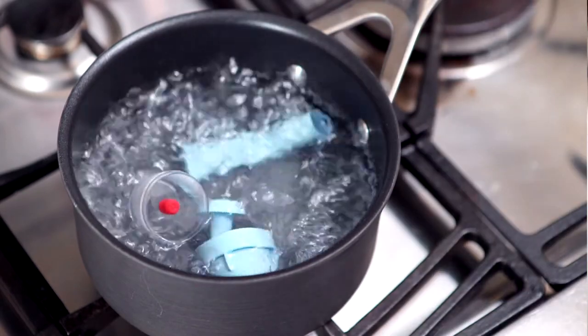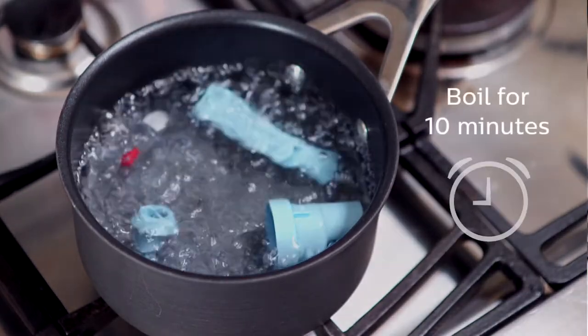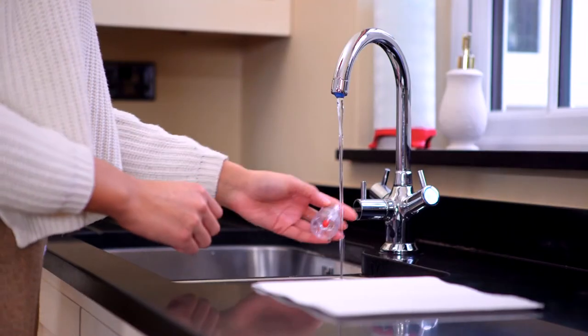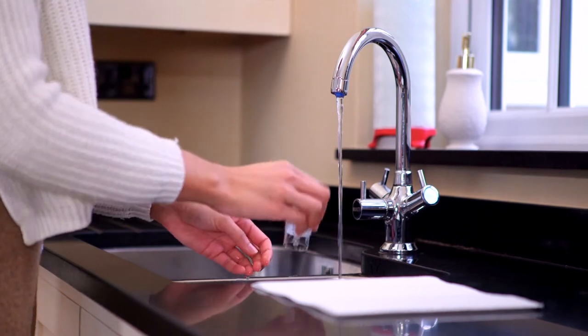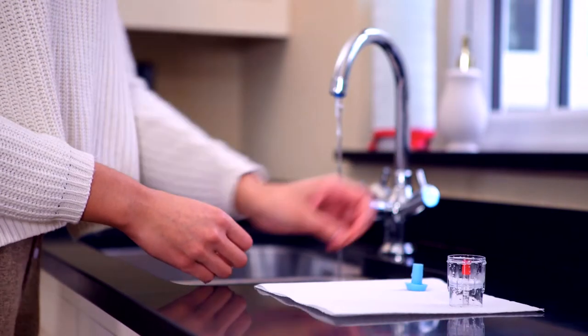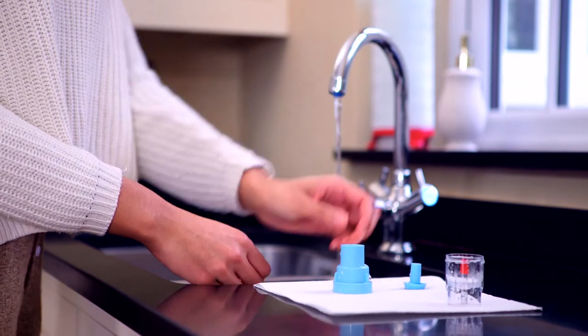Once a week, boil the Sidestream — except for the Tucker the Turtle mask and tubing — in water with 2–3 drops of dishwashing liquid for 10 minutes. Rinse all parts in clean water for 2 minutes. Shake off excess water and leave to air dry. Do not towel dry. Once dry, reassemble the Sidestream for storage.